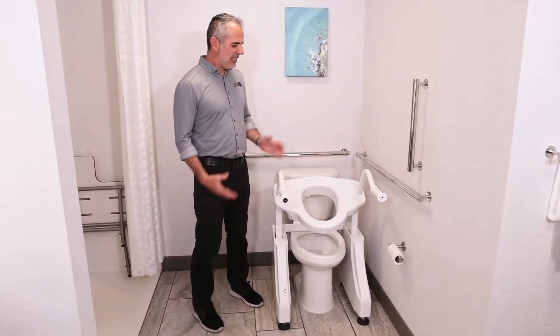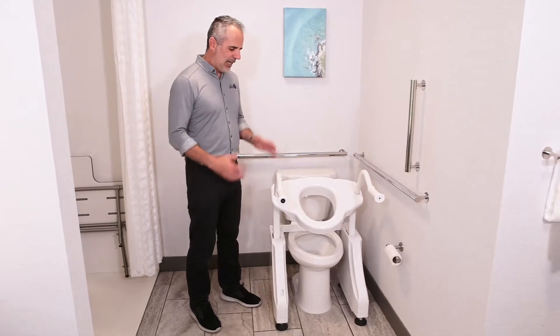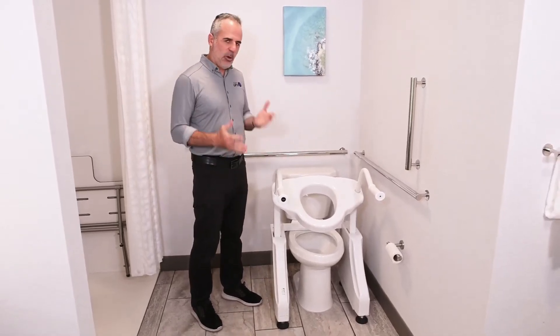Hi, this is the Dignity Lifts DL1, our Deluxe Electric Toilet Lift. This is my favorite toilet lift. It's great for home use.